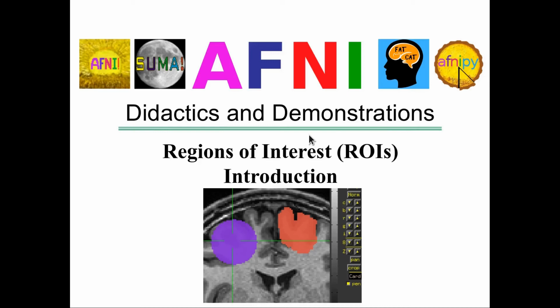Today we'll be discussing regions of interest, also known as ROIs. This part will be the introduction to the ROIs.